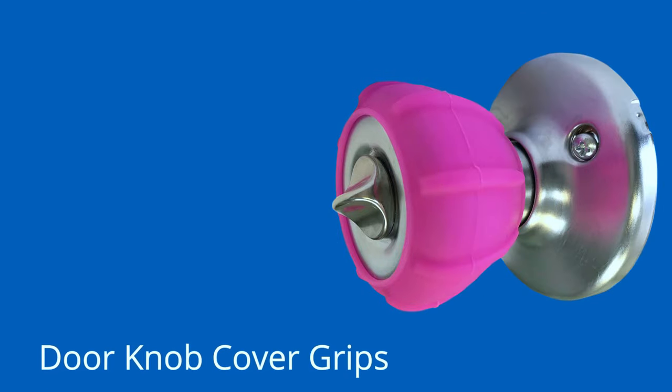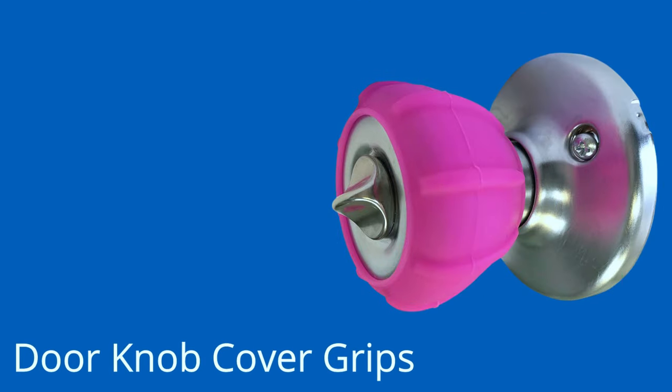Doorknob Cover Grips — people with arthritis may have a lot of trouble with rotation movements. If you have ankylosing of the wrist, that can be very hard on you. These doorknob cover grips can make it easier for you to turn knobs.